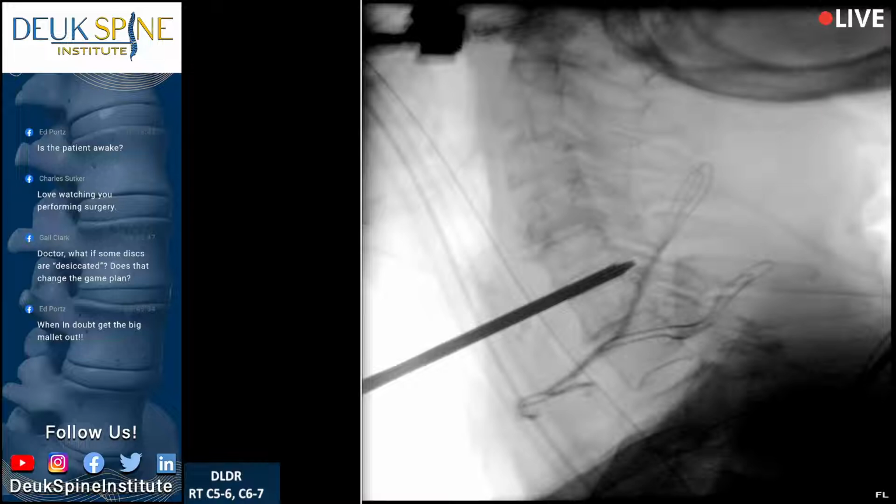And Flynn, yeah, why don't you show our audience one more time how the Deuk laser disc repair works to repair the annular tear and get rid of the herniation. Can you run that video for us, for those who missed it? Type up your questions, and I'll be happy to answer them for you as soon as I'm done. We'll be done in about 15 minutes.